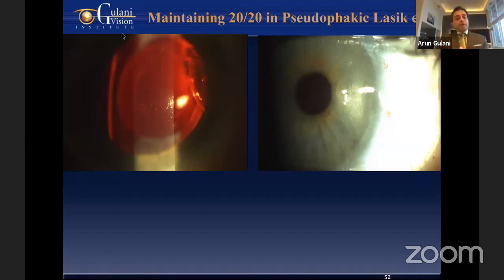So the importance of doing these surgeries cosmetically well is you are now able to do refractive surgery. You're now able to make them premium cataract surgery candidates. So many of your patients who deserved premium cataract surgery, laser vision surgery, keratoconus surgery, now are candidates because you haven't cut the cornea, you have restored the tissues, and the eye is back to normal and precise for your accuracy.